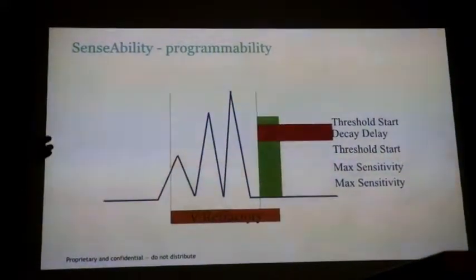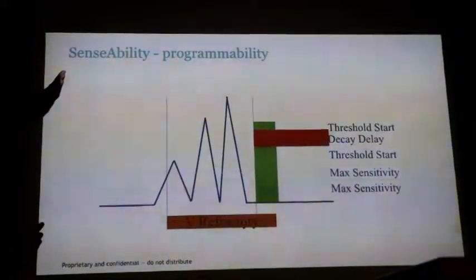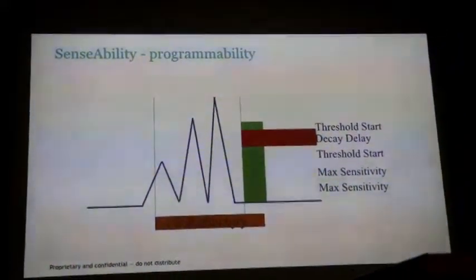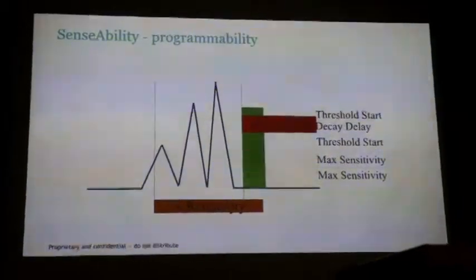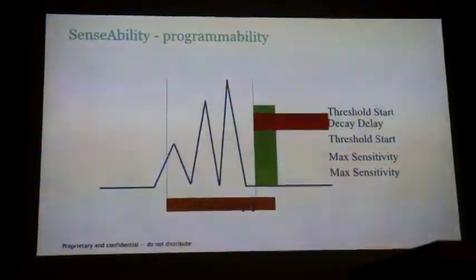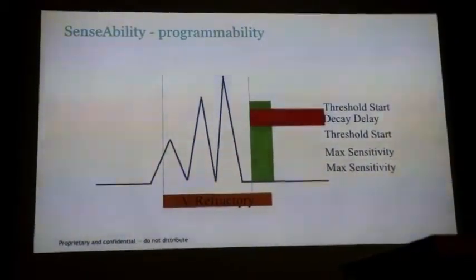So there's all this technology, all this stuff, and it's kind of like, well, which one do I use for which situation? So if we walk through them, this one here, the only time you want to extend the ventricular refractory period is if you're double sensing the R wave. So if you sense the R wave twice, and it's an implant, you should probably move the lead.